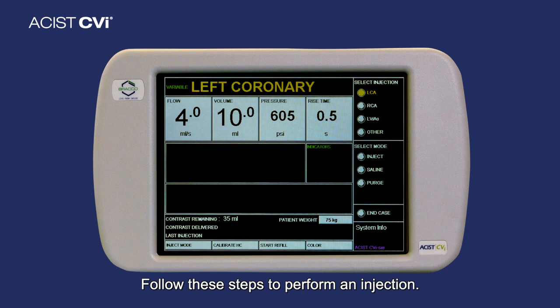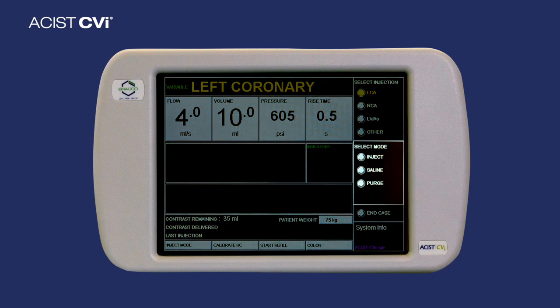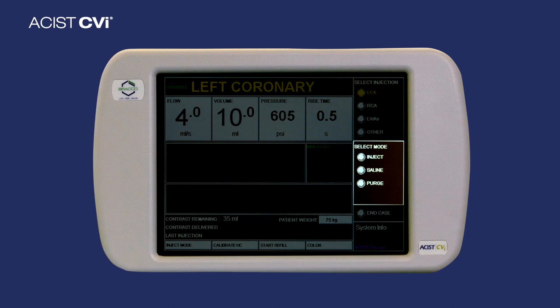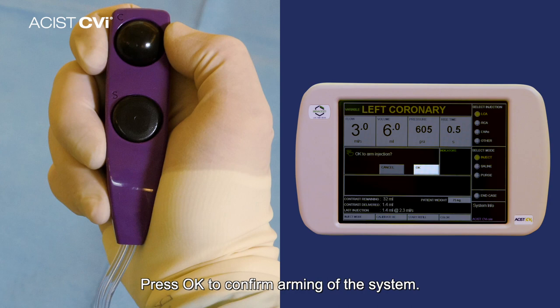Follow these steps to perform an injection. Step 1. Arm the injector. In select mode, press Inject. Step 2. Press OK to confirm arming of the system.